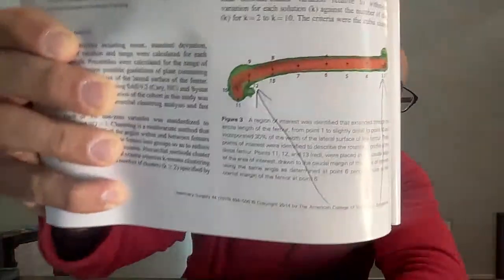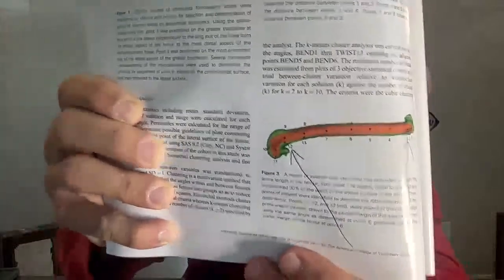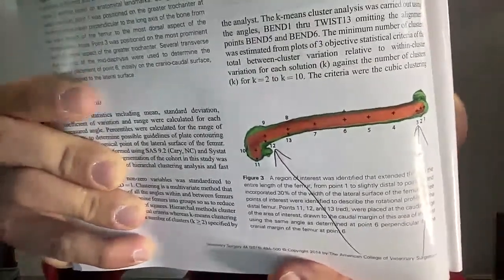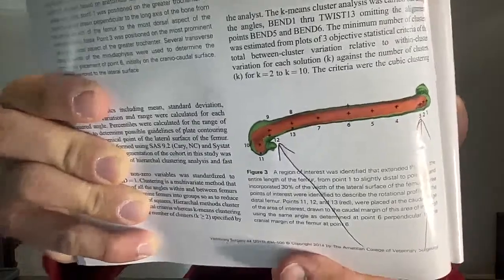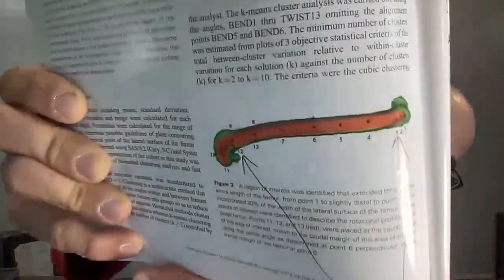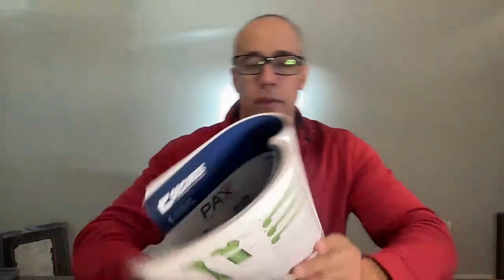And then here you can see I pointed arrows, and we'll go over this in a minute. The arrow on this side is the greatest twist, and the one on this side is the greatest bend. And so that's the picture there.